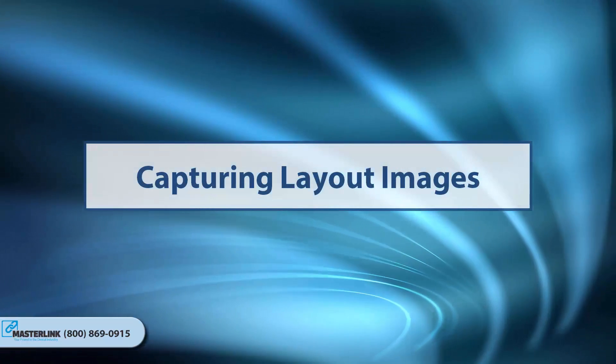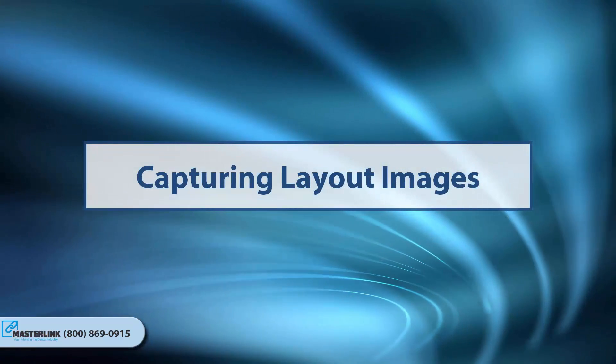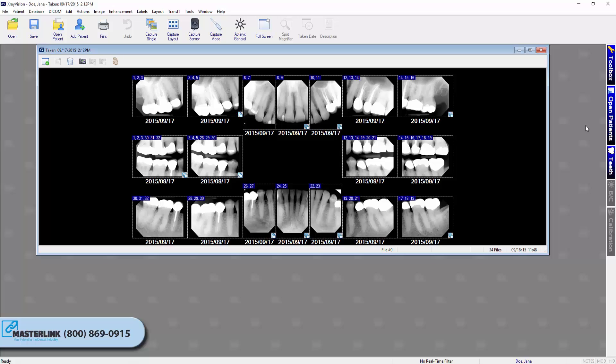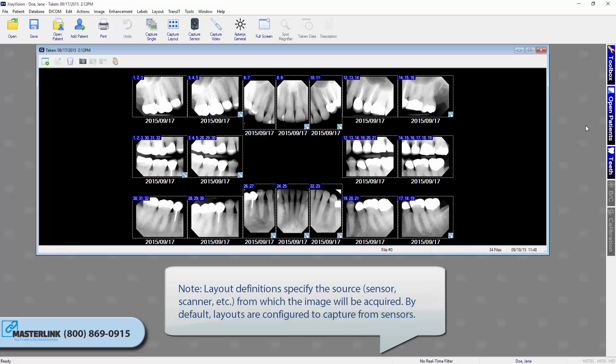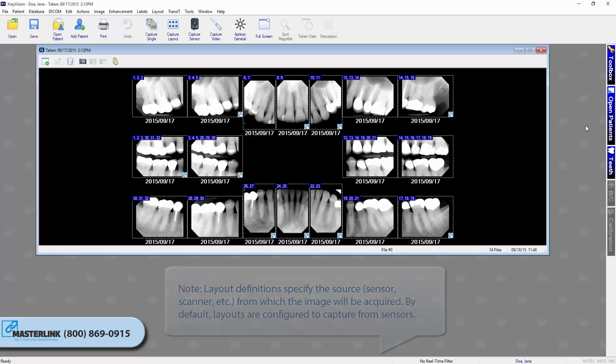Capturing Layout Images. A layout is a group of tiles displayed in a single workspace. Tiles are grouped anatomically to reflect tooth positioning in a patient's mouth. Note: layout definitions specify the source, sensor, scanner, etc., from which the image will be acquired. By default, layouts are configured to capture from sensors.